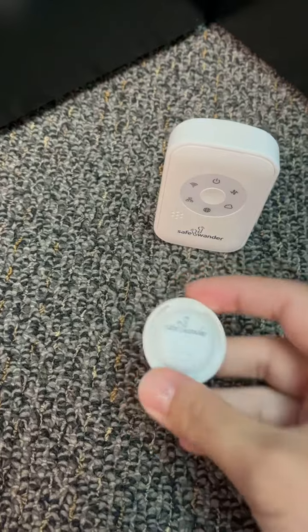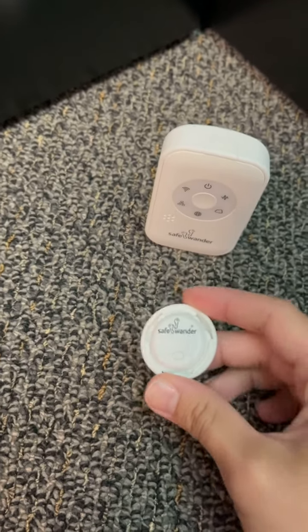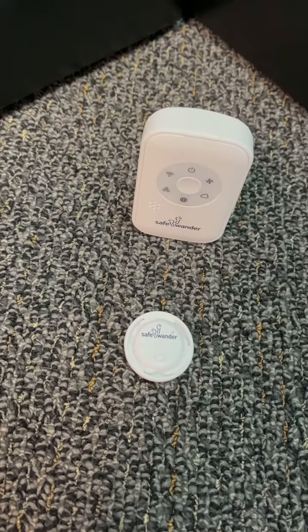This is the sensor. It's worn on the patient's clothing and monitors body angle. If the SafeWander is attached to someone and detects a change in body angle, it will alert the caregiver that someone may have exited the bed or exited a chair.